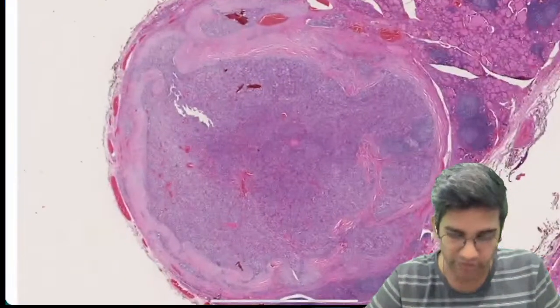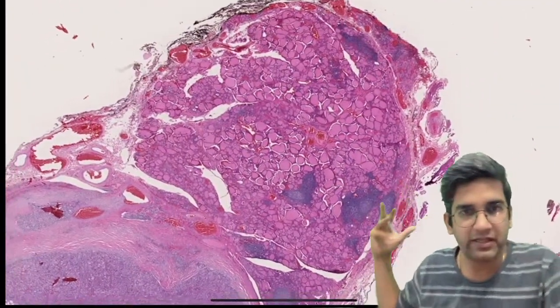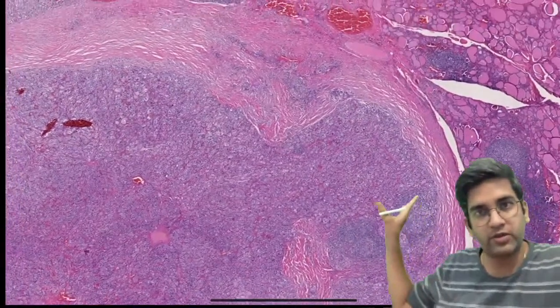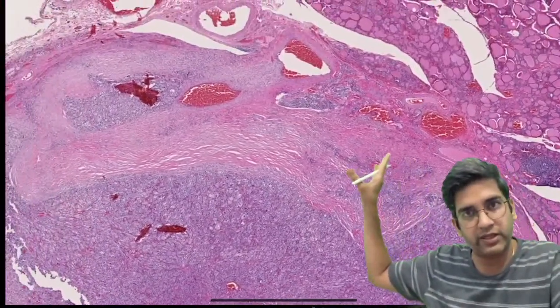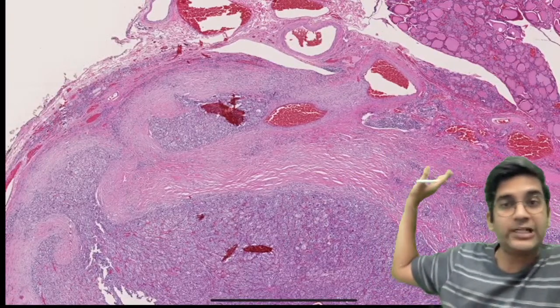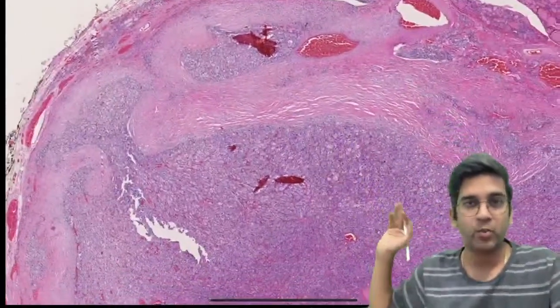Let's go to the case we saw. Look at this. I hope you can see this case. This is from WHO, from the blue book. A normal thyroid, maybe a little bit of lymphocytic thyroiditis here. Now I'm just going to draw a capsular outline. Fine with me. Tell me, what is the right route of this capsule? This here, the first one, or this here? Which do you think is a normal outline?